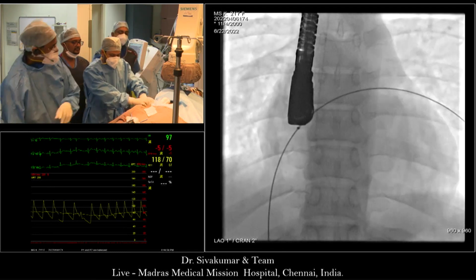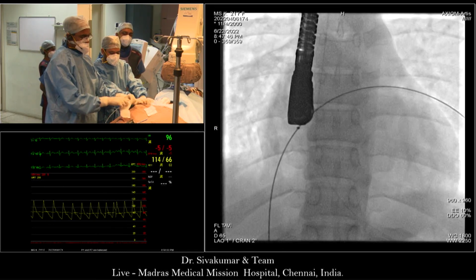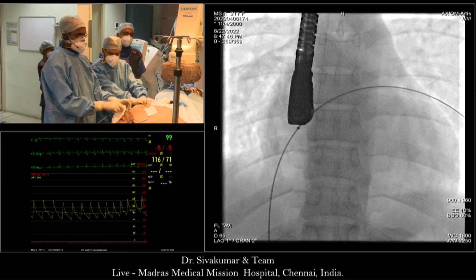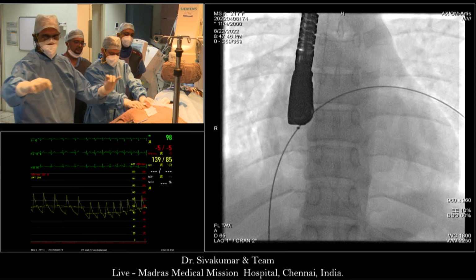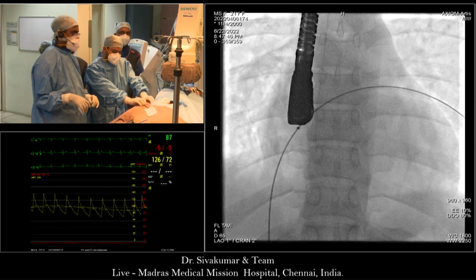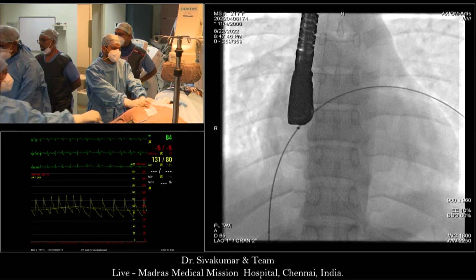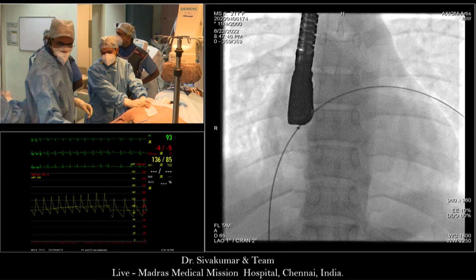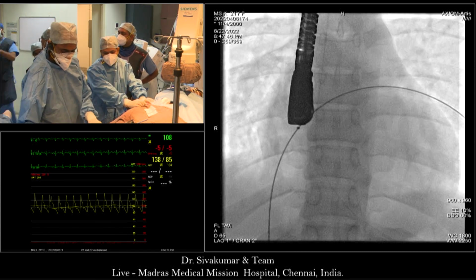If we do some balancing technique or something more predictable, and the device position is okay, and then it prolapses with or without a wiggle, then we can be sure that 36 millimeter is too small. But in this case, we don't know. I still believe that 36 was actually an okay device.